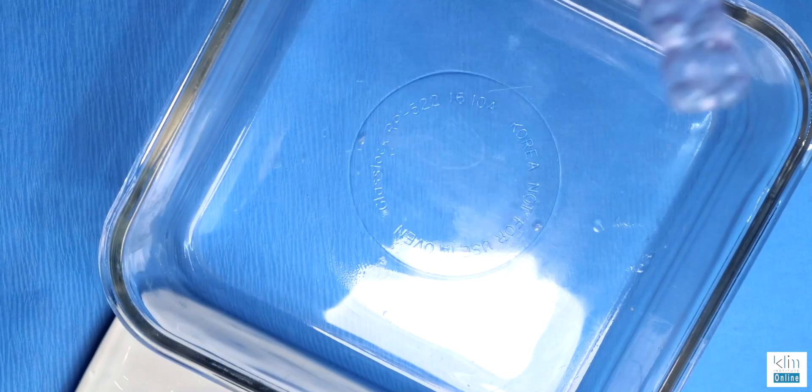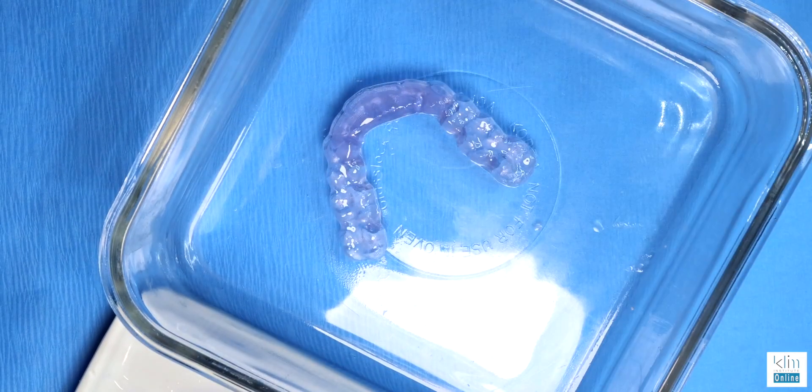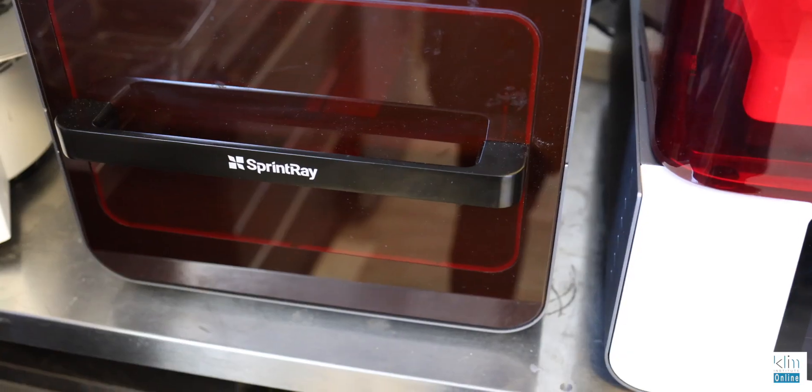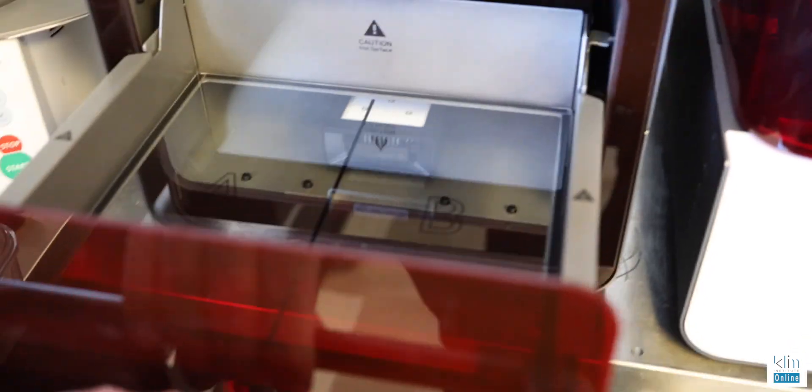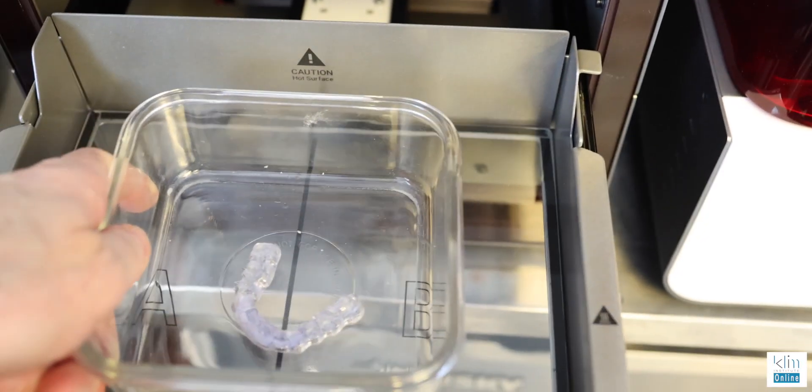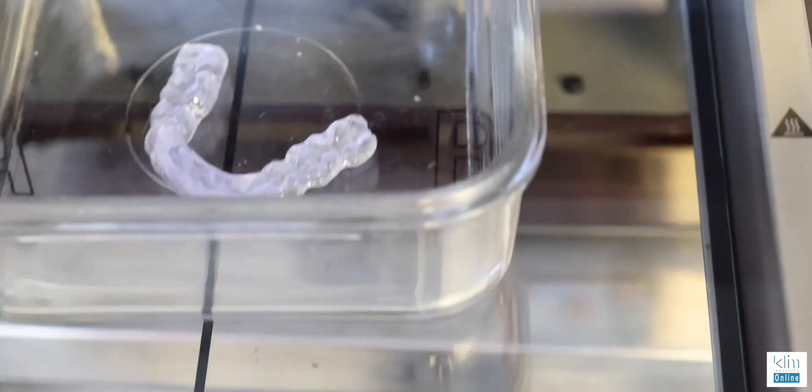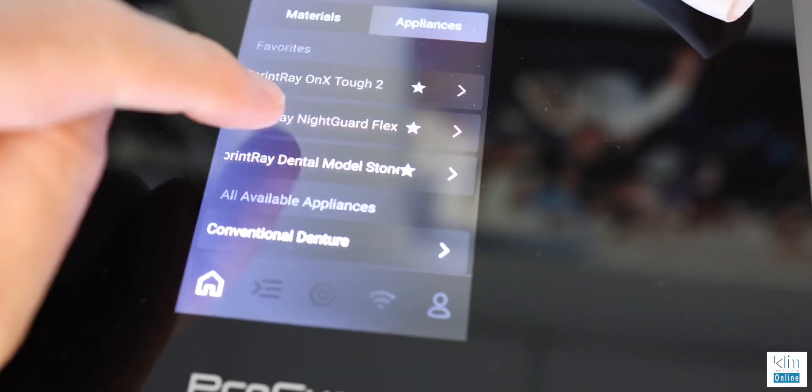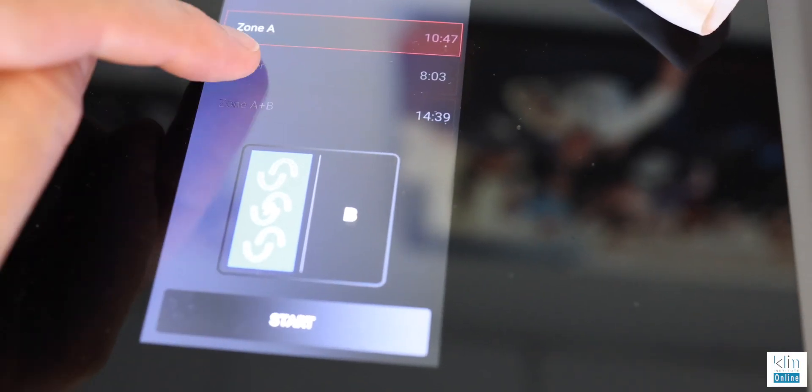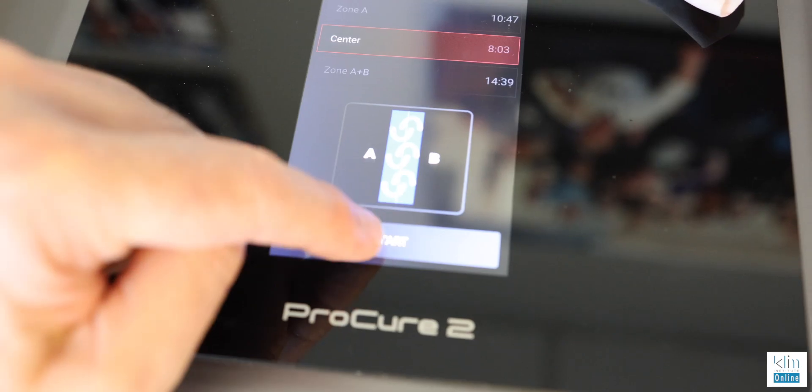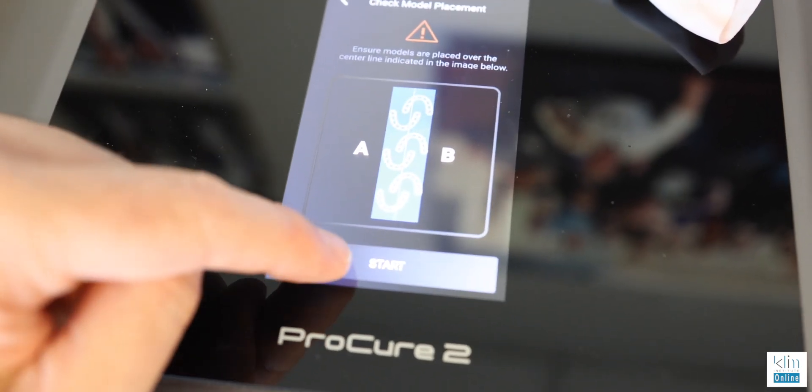To keep the ProCure from getting gooed up with uncured resin, we're going to use a glass ceramic. We're placing the internal component of that appliance down. Place it in the middle and then choose the middle curing option, and that will take 8 minutes.